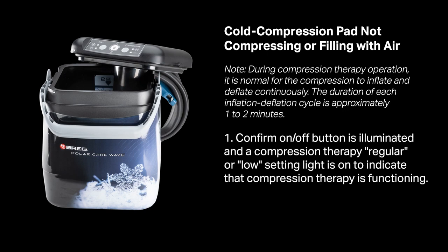Confirm the on/off button is illuminated and a compression therapy regular or low setting light is on to indicate that compression therapy is functioning.